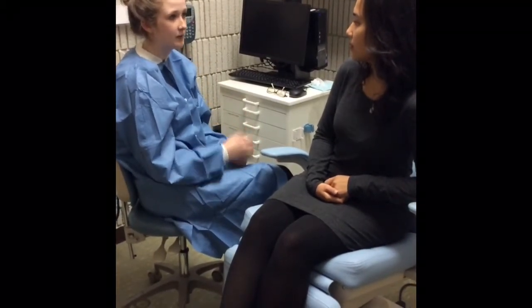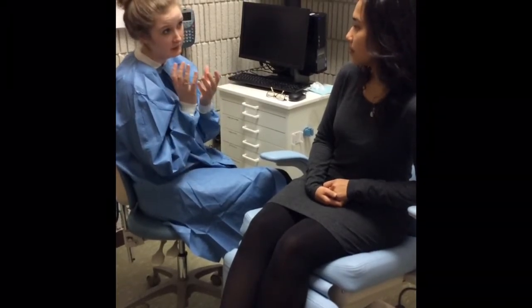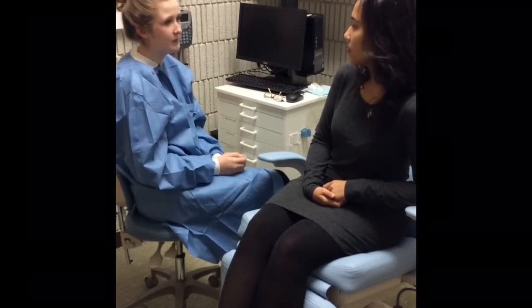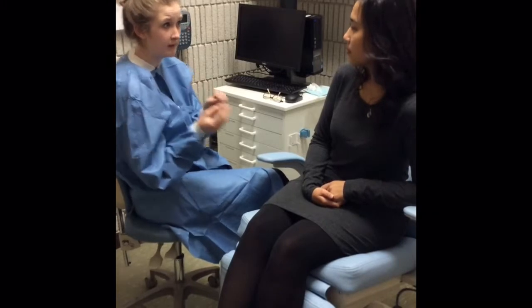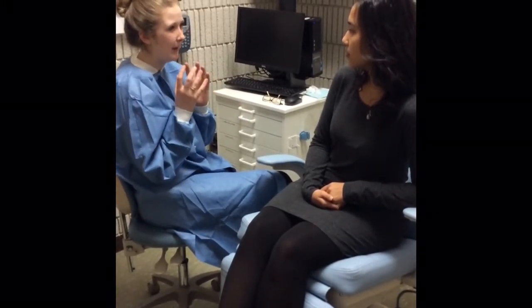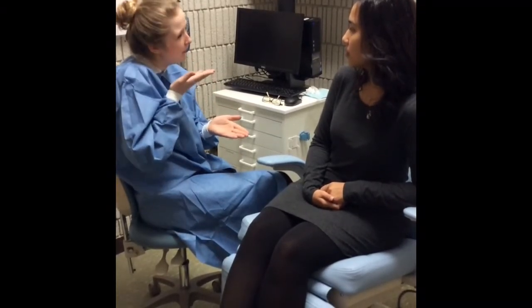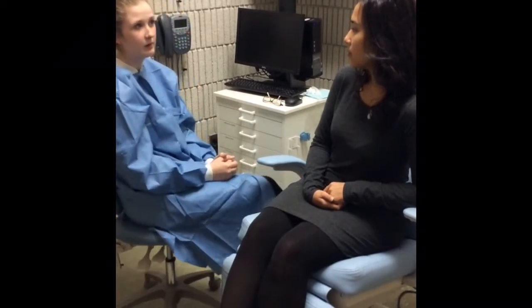We want to take an X-ray that will show every area of the tooth that you think you hit to make sure that there's no destruction up there, because we want to make sure that we see every area, which the 3D image will help us do. We don't want anything traveling or anything bad happening above it. We want to make sure that the tooth hasn't actually gone up into your jaw more. So that's the reason why we want to do the 3D imaging.